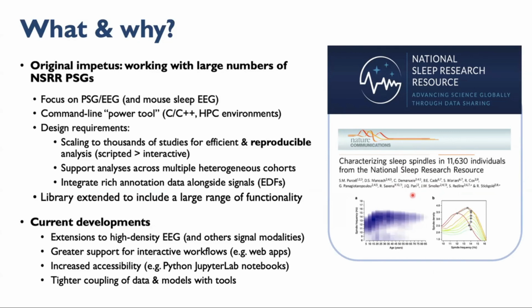So Luna is fundamentally a command line power tool designed to work best in a high-performance computing environment. The focus on scaling automated and reproducible large-scale analysis more naturally led to scripted rather than interactive workflows. And two other design requirements were, first, to facilitate working across multiple, sometimes heterogeneous cohorts, and second, to be able to handle rich annotations and metadata alongside physiologic signals.